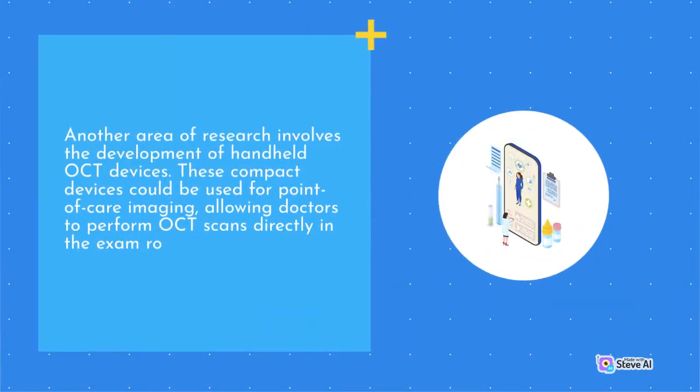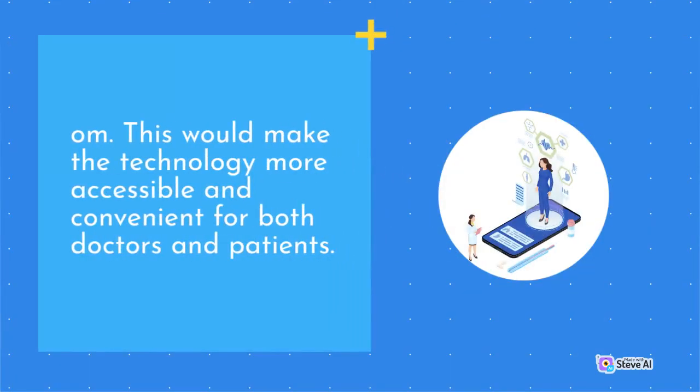Another area of research involves the development of handheld OCT devices. These compact devices could be used for point-of-care imaging, allowing doctors to perform OCT scans directly in the exam room. This would make the technology more accessible and convenient for both doctors and patients.